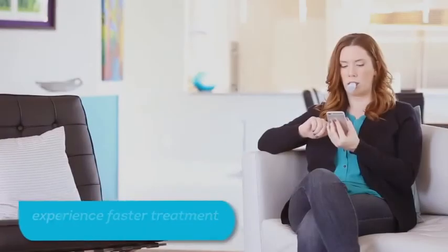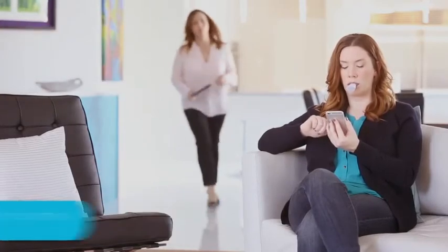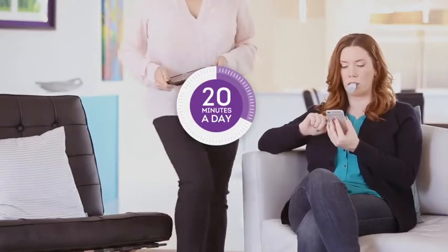With Accelident, you will experience faster treatment and less pain than traditional orthodontic methods. Treatment takes only 20 minutes a day, making it easy to fit into your daily routine.